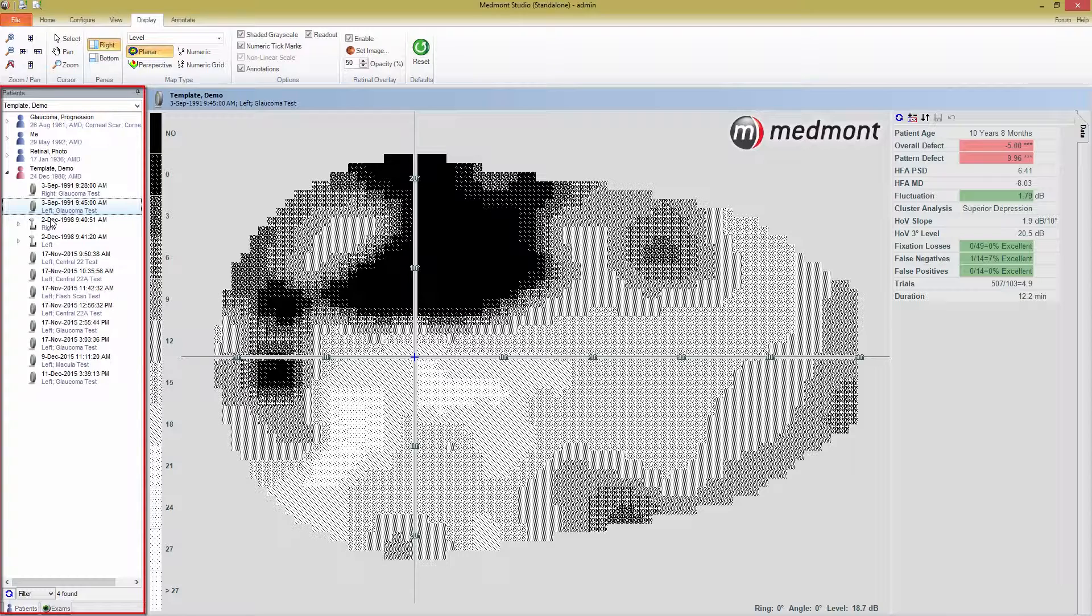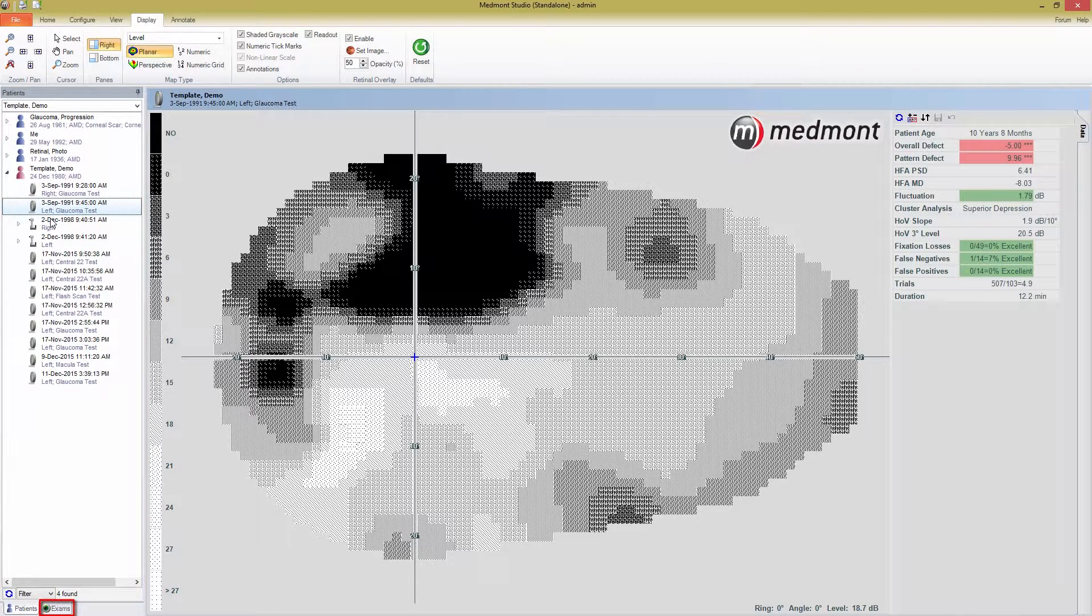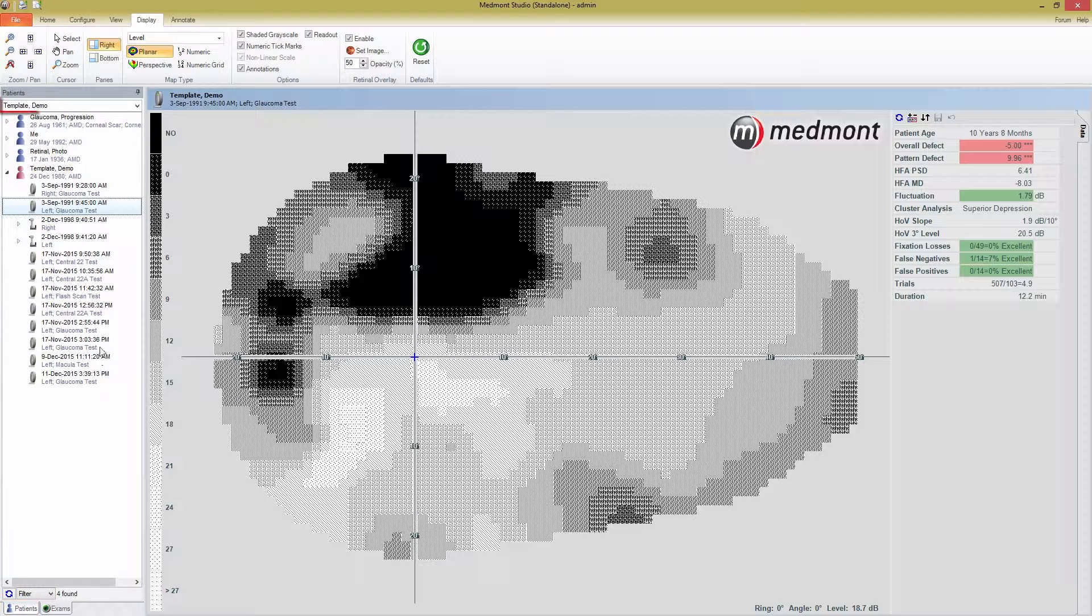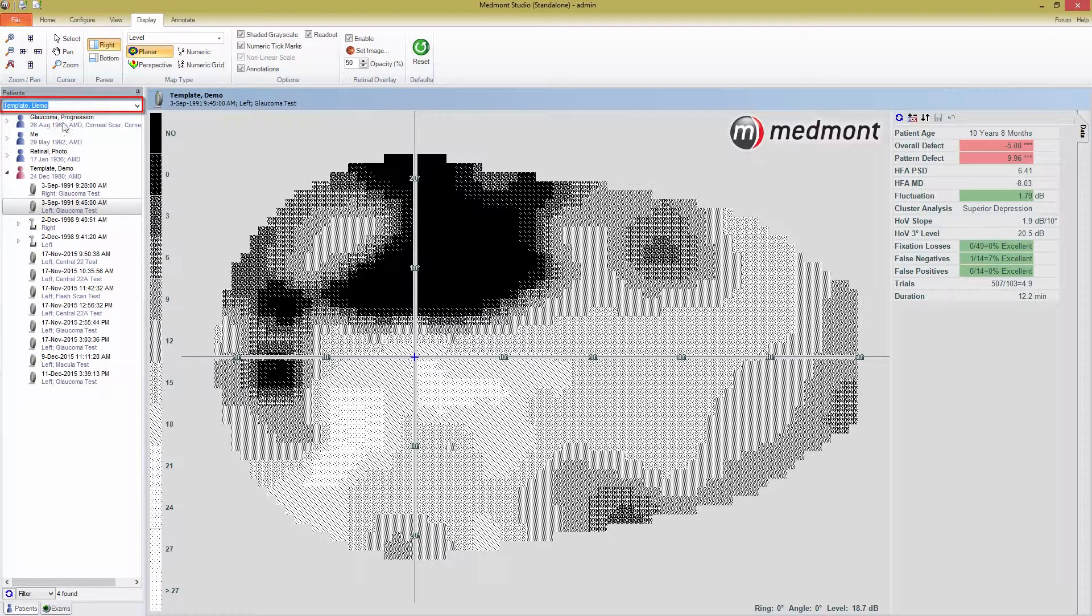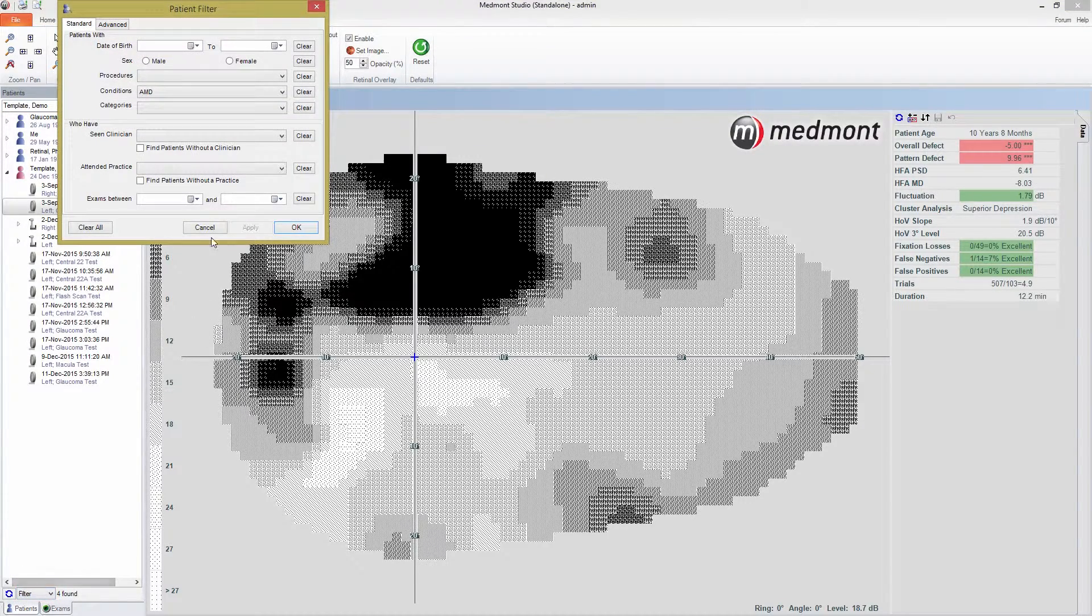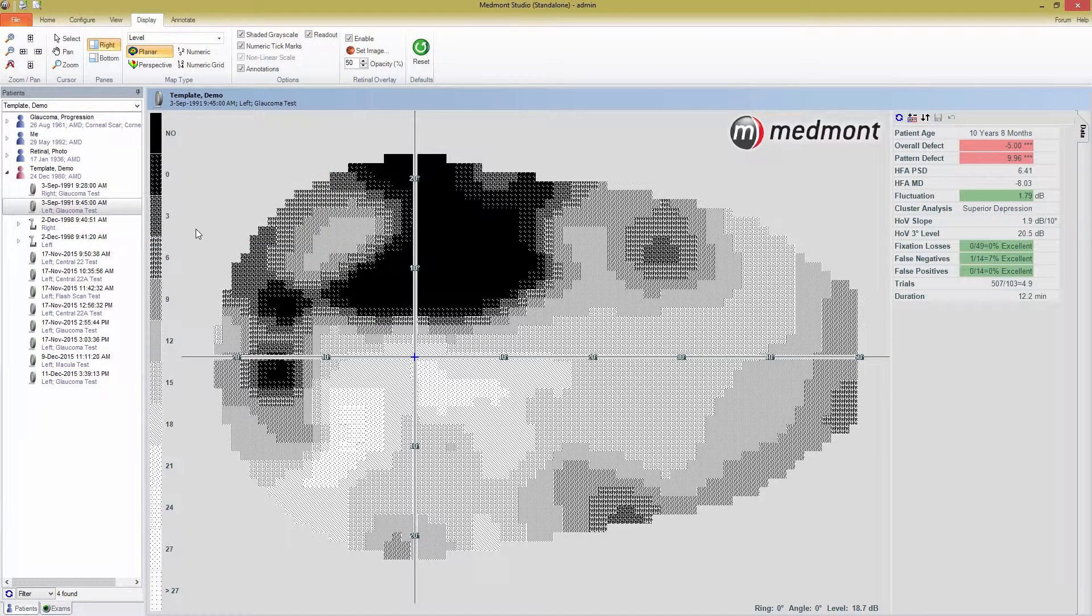If you're looking for a specific exam, you can press the Exams button at the bottom of this panel. Pressing the Patients button will bring you back to the patient view. You can search for a patient by typing your search criteria into the text box at the top of this panel, or set a filter by pressing on the Filter button at the bottom of the panel and defining your filter criteria. Now that you've selected the exam you want, you'll be presented with an image of the data in the main screen.